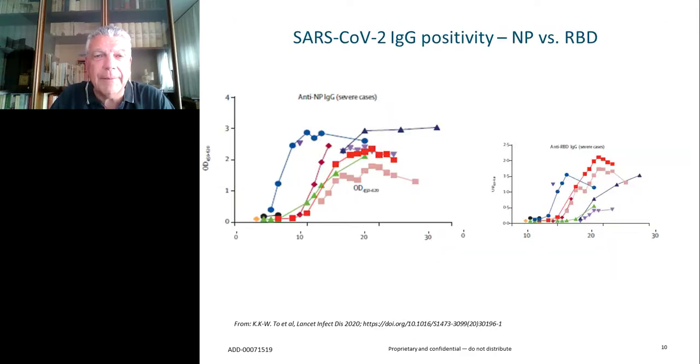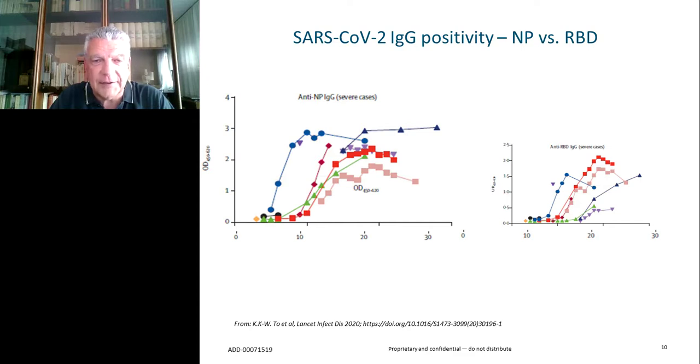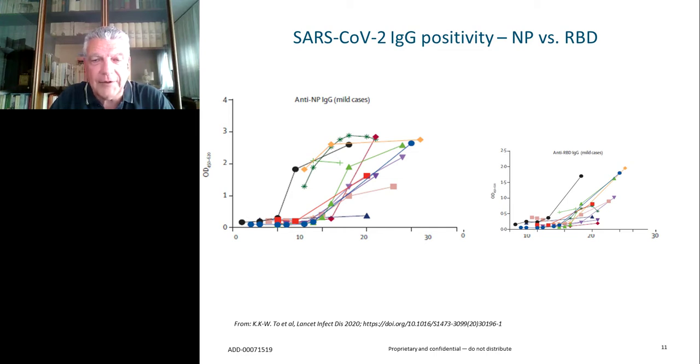And you may have an even better glimpse if you look at this series of patients that have been assayed by an assay directed against the nucleocapsid or against the spike RBD domain. On the same scale of intensity of the result, you can see that the anti-NP IgG appeared in general earlier and attained higher levels. And we have another example here. Another thing you may note is that in severe cases such as those, the response tends to be stronger, whereas in mild cases it tends to be weaker and also possibly delayed in time. And this is something we will deal with near the end of our presentation today.